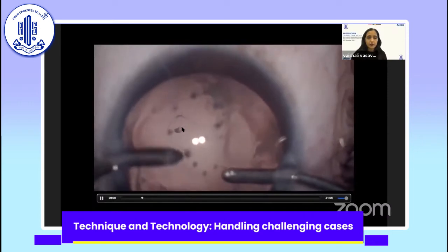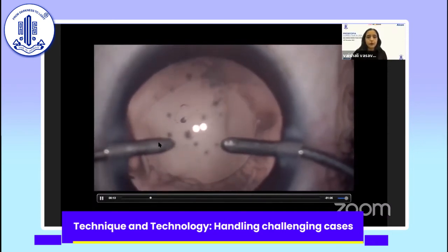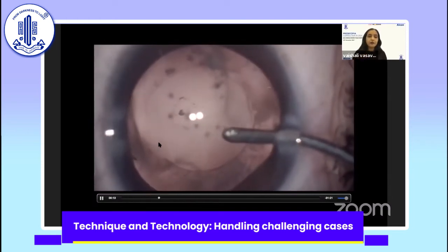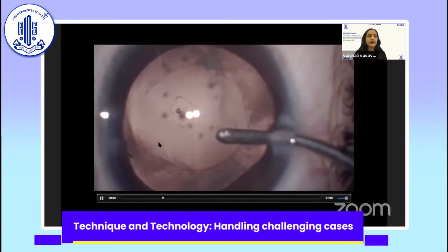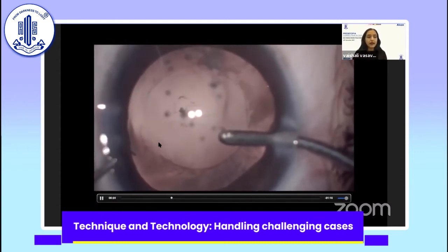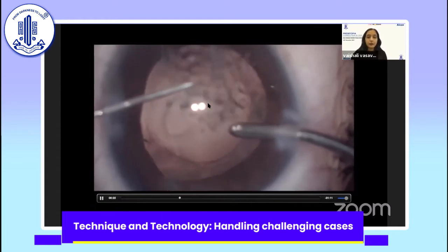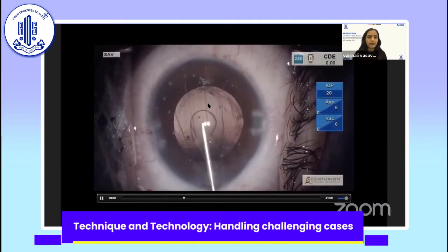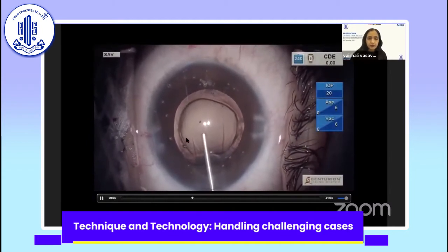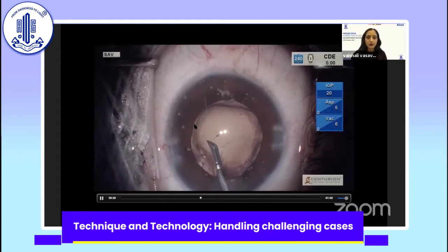Just keep, while we are polishing, can you notice this posterior capsule rupture that happened? So a posterior polar cataract, even if you ended up with a clean bag, please don't take this lightly. We have had cases of rupture during polishing, during even stromal hydration. So they are weak capsules. I know that this was planned for a so-called advanced technology IOL. So you want to have a crystal clear capsule, but instead you have ended up with an even clearer visual axis now. So now what do?